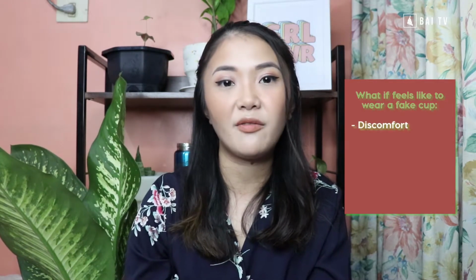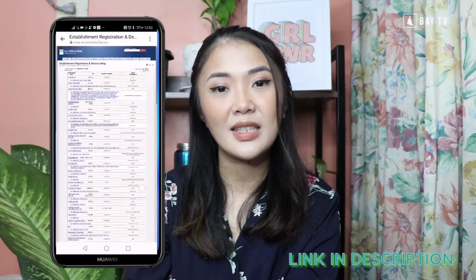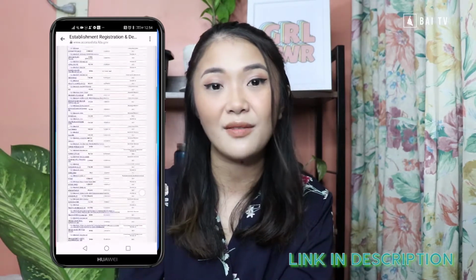I've actually talked to women who've used fake, nameless, and cheap cups, and they reported that using it was so unpleasant. They've shared stories of discomfort, not getting along with their cups, and ultimately disliking the experience of using a menstrual cup. So how do I know if I'm using a safe cup? A simple cross-referencing on the FDA website will let you know if the brand that you're using has actually been approved as safe to use.